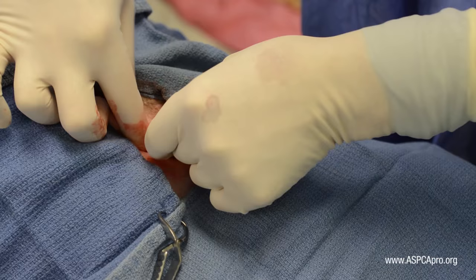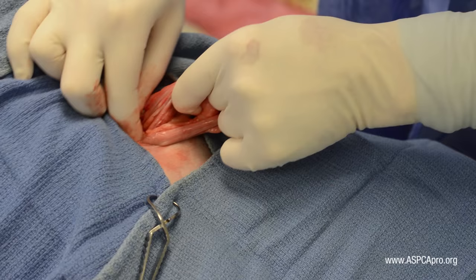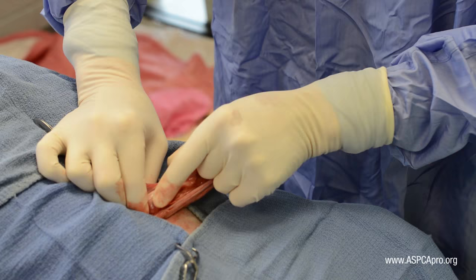The goal for each of these patients is to place the incision over the ovaries. In general, the ovaries are less mobile than the uterine body in dogs.